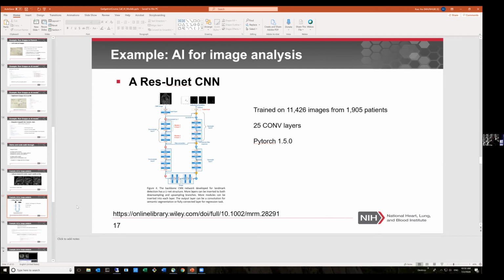My solution is that we implement a rather full-scale neural net, based on the residual U-net structure. The input is a single picture, and the output is the landmarks, which are detected using a so-called heat map, a rather popular scheme in computer vision for detecting human pose, or, let's say, the position of your arm.